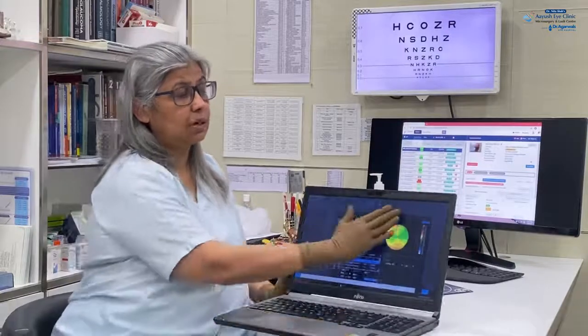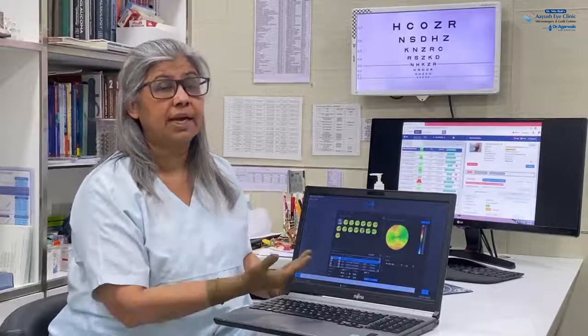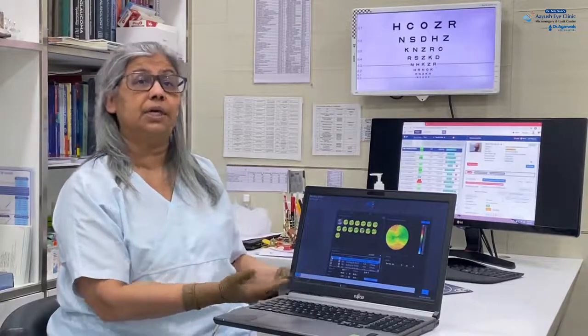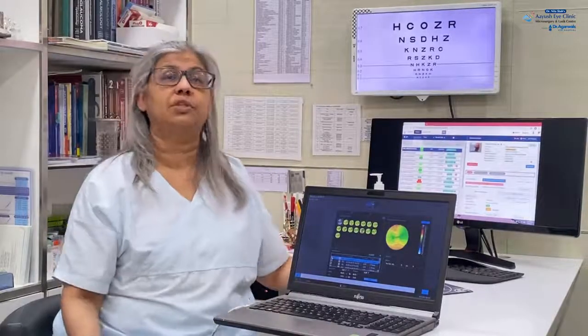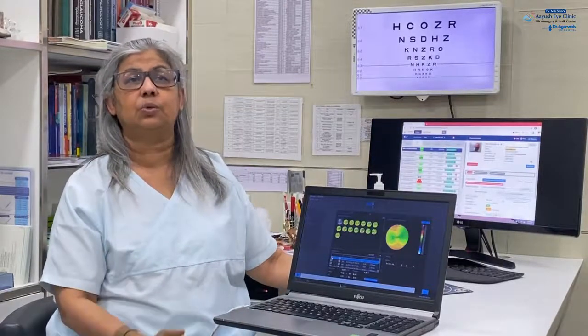We don't have to type in or send it in there separately, and according to that the Contoura treatment carries out a smoothening of all the 22,000 points which have been scanned on the cornea, and that is how a Contoura treatment can be carried out. We will now proceed into the theatre and see what we do there.